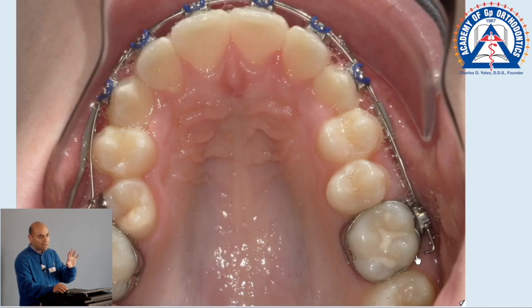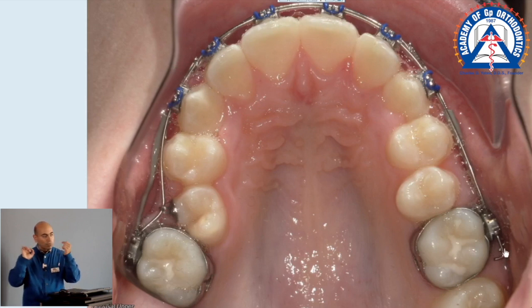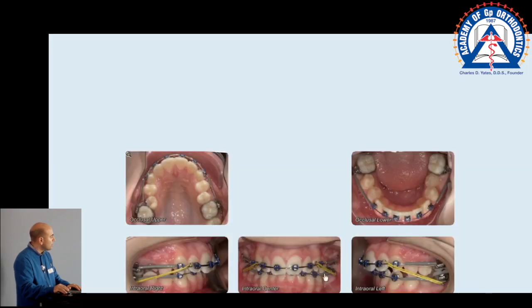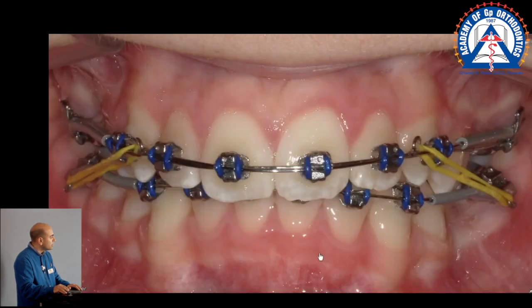The last question was: where do you cut it — do you need to go all the way around, why not do a sectional? The answer is that if I do a sectional somewhere towards the anterior portion of the mouth, as the wire recoils there is a possibility that end may start poking the patient in the front. So I might as well leave that wire all the way through — as it gets longer, it gets longer in the back and we don't have to worry about any soft tissue damage. You can see from the side we have a deflection and then we go all the way around.